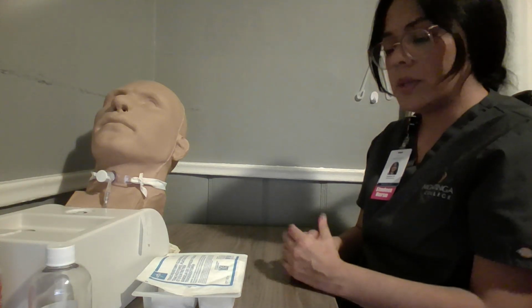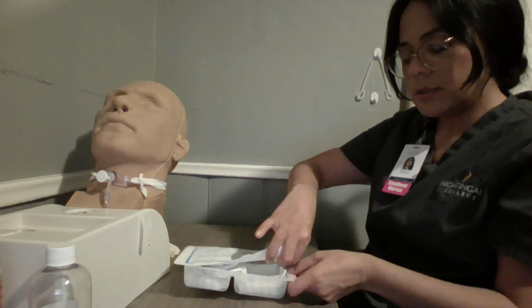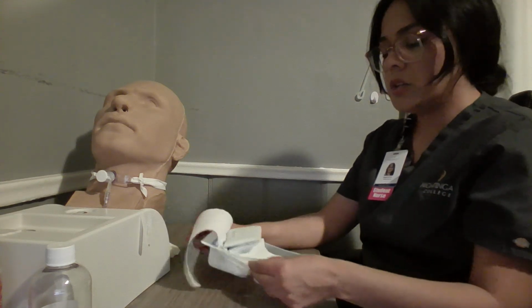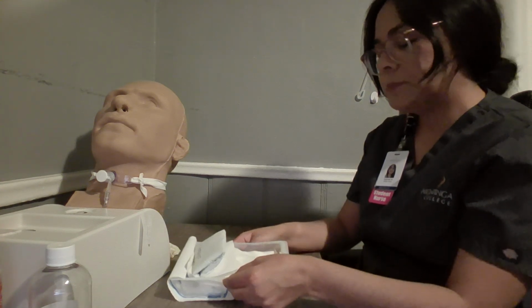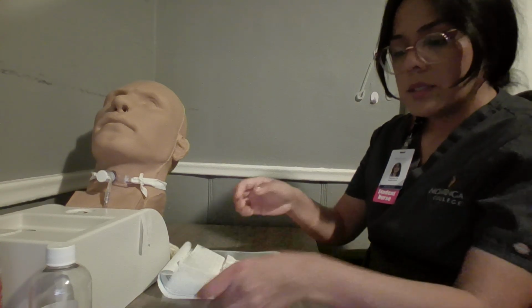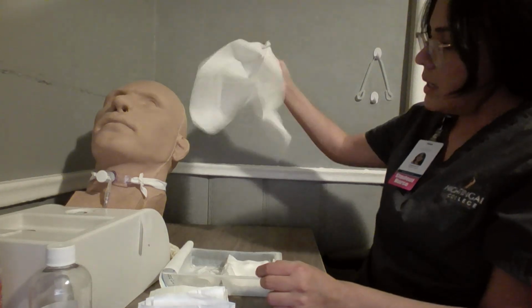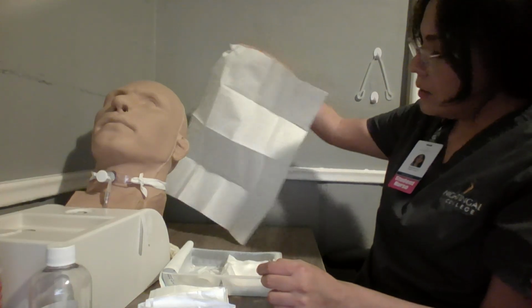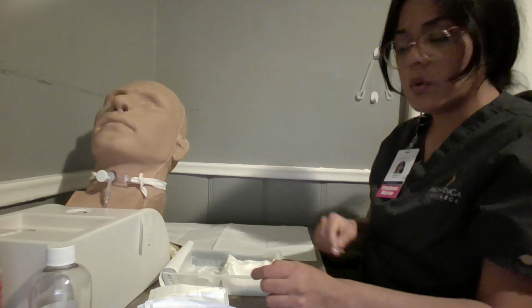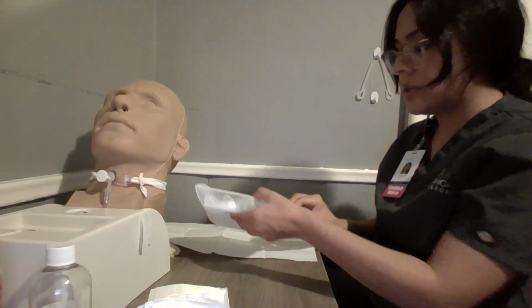I will open the tracheostomy kit with the sterile basins. When opening up the tracheostomy kit, I want to make sure to open it away from me. And I will now take out my sterile gloves. I will take out my sterile drape. I want to make sure that I only touch the corner side of my drape. And I will lay that down on the table here, flat. I will place these items in the center of the sterile drape.